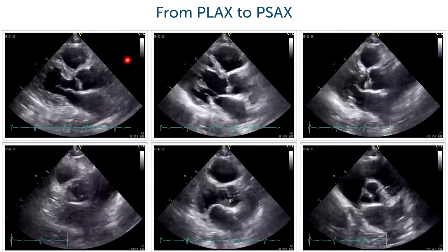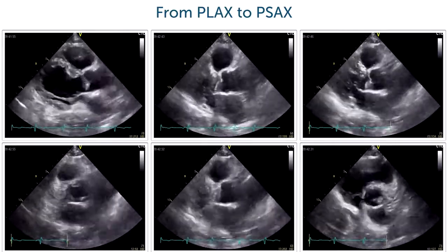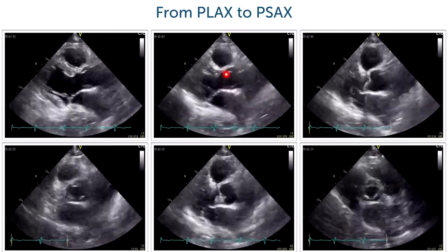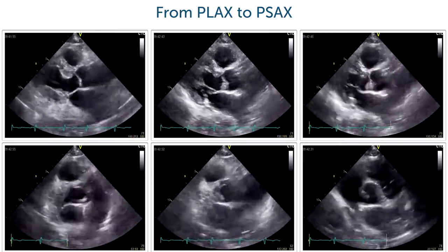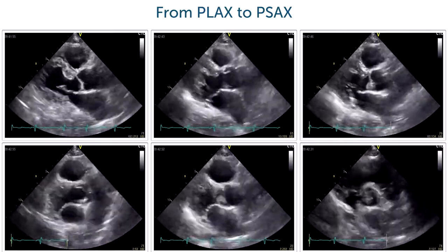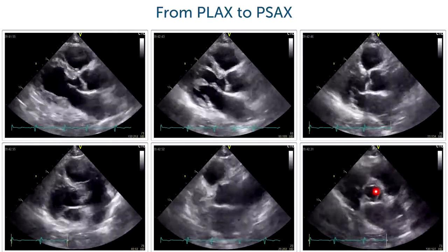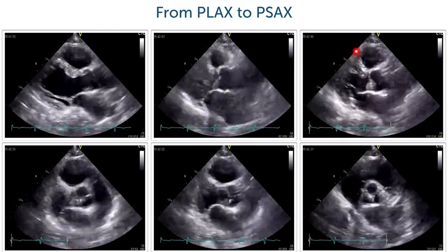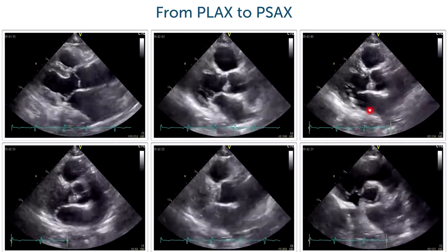Now you start with the long axis view, we saw that in the demonstration, and while you rotate, you will see that all of a sudden the longitudinal orientation or the full length of the ascending aorta will not be visible. You will lose this right here until the aorta starts to close here. So does here also the ventricle. And when you have a view where you are able to nicely visualize the three cusps of the aorta, you're in the correct view.